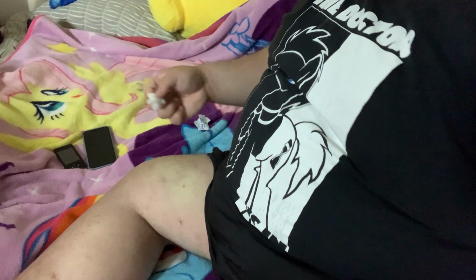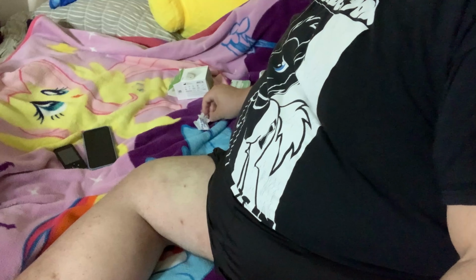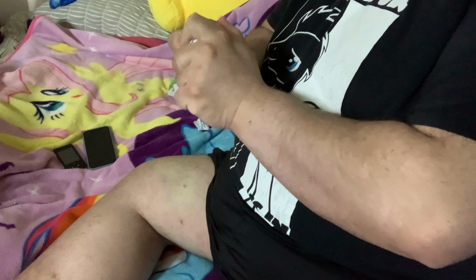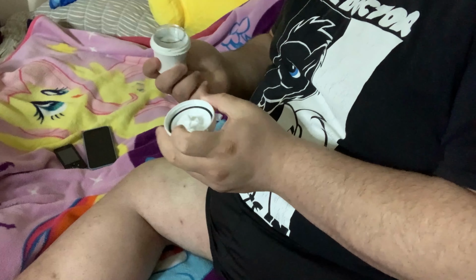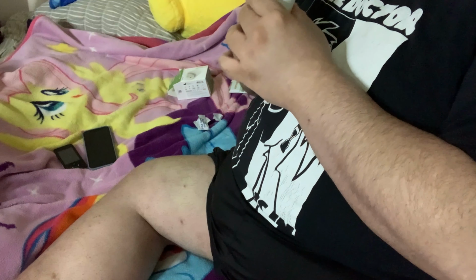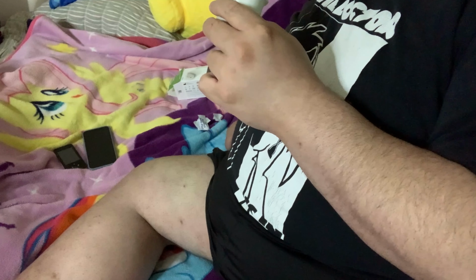And you're wondering, why am I putting it on my leg area? Because I know it's not recommended, but I want to show my Dexcom sensor so people know I'm type 2. It gives a good little hint of what I have to monitor for my diabetes, of course, type 2. Here you go. That's what it looks like. And I believe the sensor was this way. I think I'm going to point it this way this time. If it's upside down, it's fine.